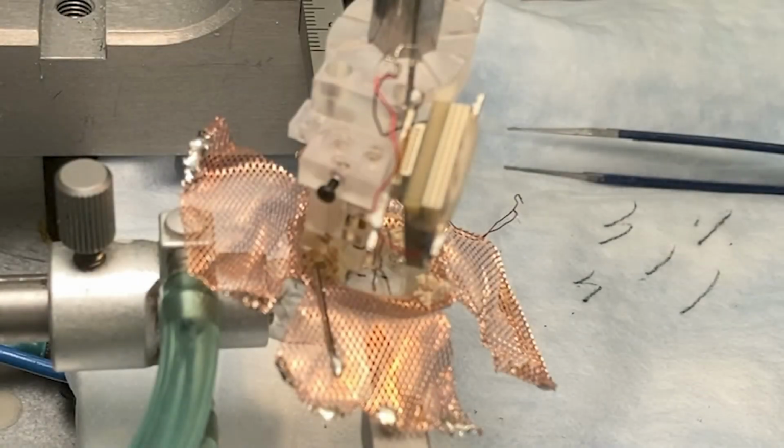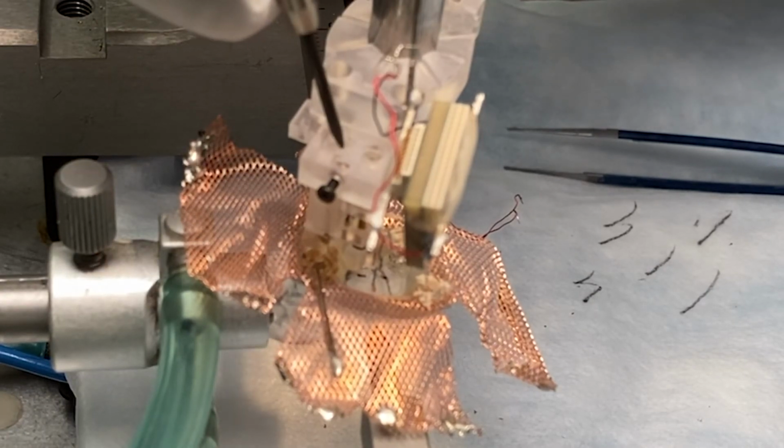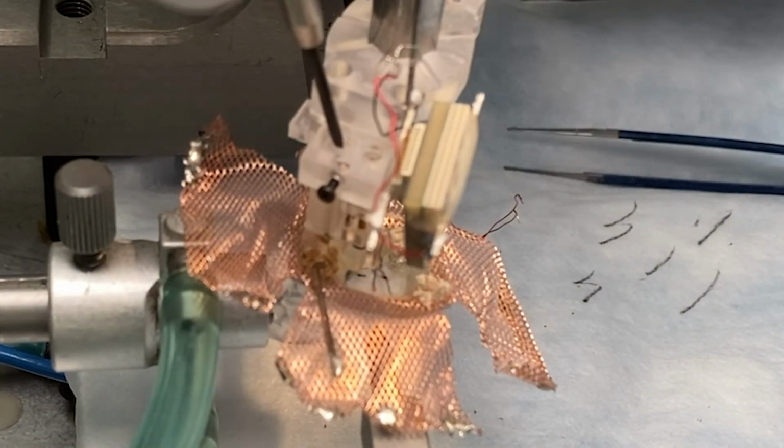Then we need to solder the PCB to the metal bar, and then loosen the shell screw. Once this shell screw, which is here in the back, is loosened, then you can start removing your device.